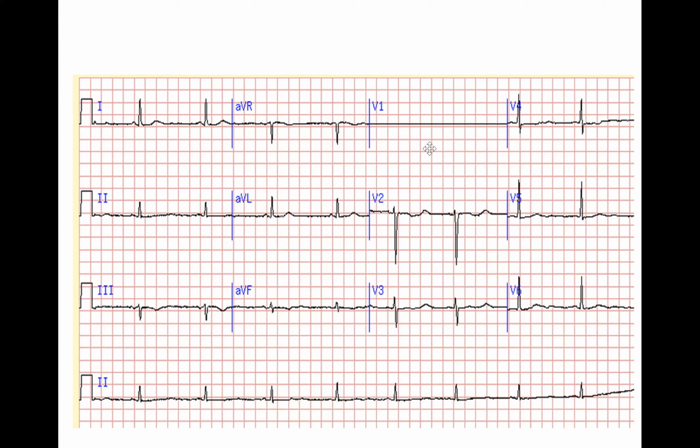So as we said earlier, once you see an ECG that looks pretty normal to you, always think of electrolyte disturbance. So this is a fairly normal wave conducting and giving you normal QRSs. There is sinus bradycardia. It looks like a prolonged QT interval. There is prolonged QT interval. If you draw an imaginary line crossing that, so the answer is right. Yes, hypocalcemia.